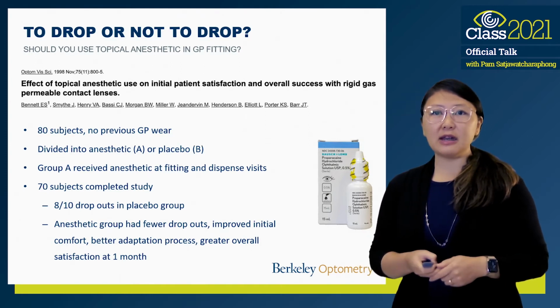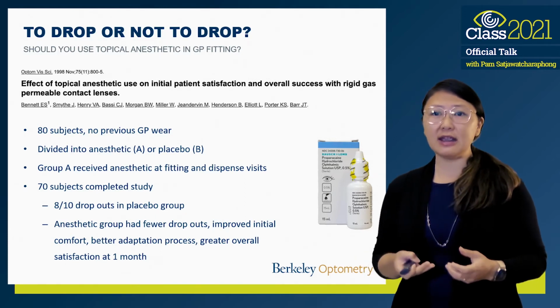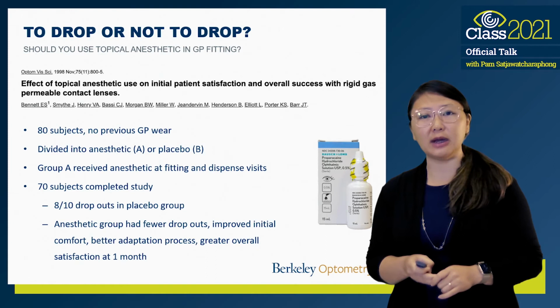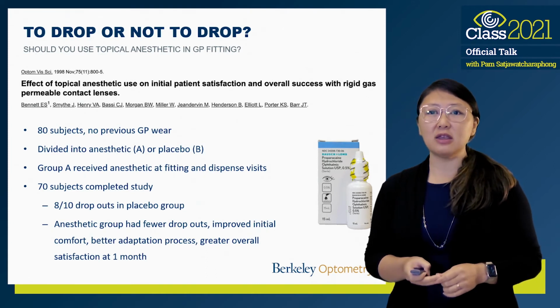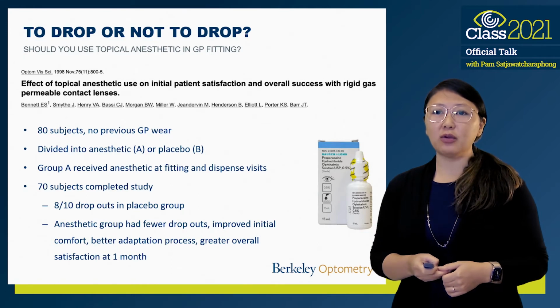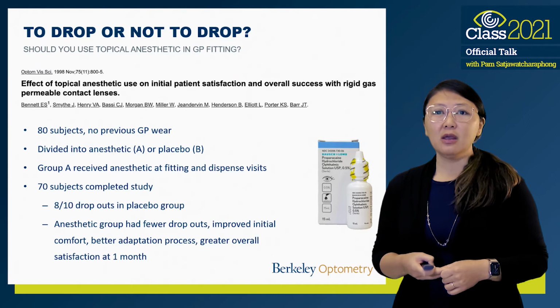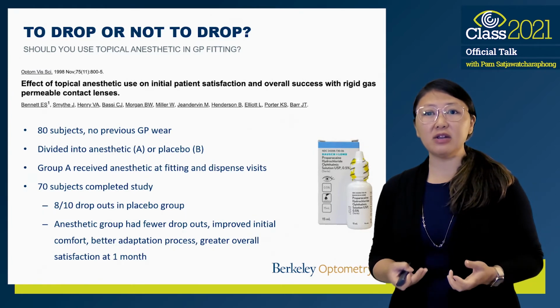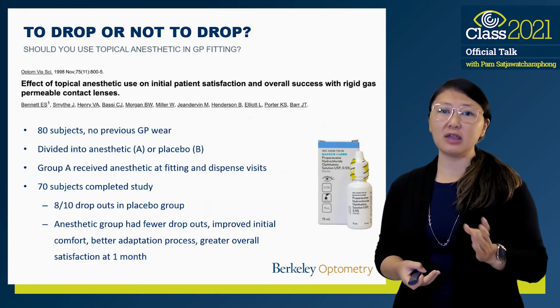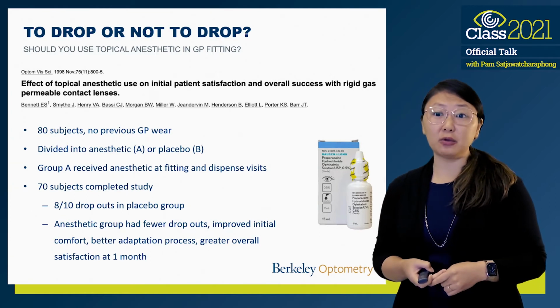A study by Bennett et al. in 1998, so this is a fairly older study, looked at 80 subjects who had no previous GP wear. And they divided these subjects into either the anesthetic group or the placebo group. And the anesthetic group received the drops at both the fitting and the dispense visits. So at the conclusion of the study, 70 subjects completed it. So that means there were 10 that dropped out. And 80% of those dropouts were in the placebo group.